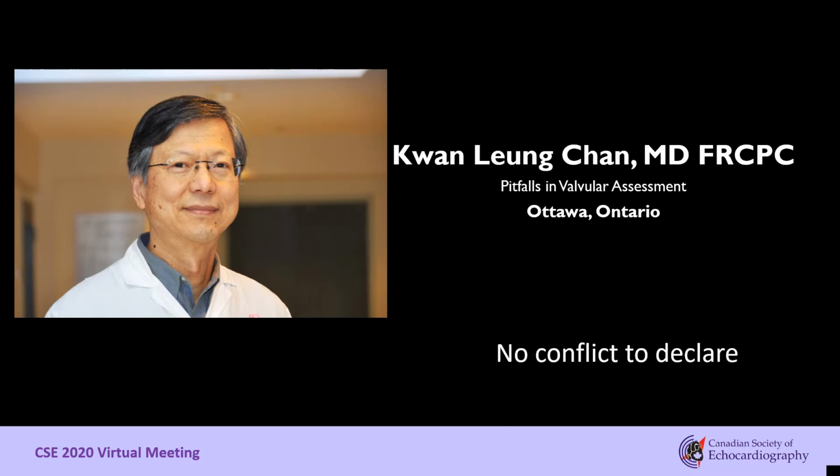My task today is to talk about the pitfalls in the assessment of valvular disease. My plan is to focus on some of the common ones that we encounter on a regular basis.